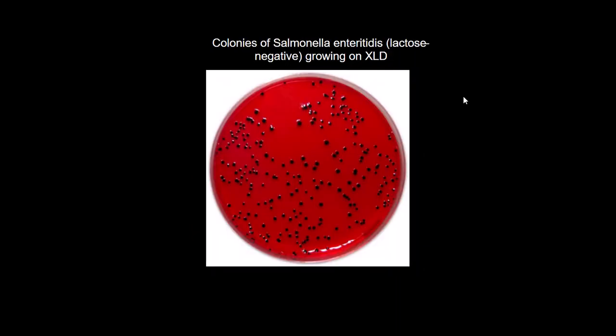So the rule of thumb here is to look for the lactose non-fermenting colonies in most of the media that we use for the isolation of the enteropathogens. Salmonella, Shigella, for example, all of them are non-fermenters. The others that are fermenters usually are not pathogens. Very important. This is the rule of thumb. But we have to look for the Escherichia coli, the pathogenic Escherichia coli that we have talked about. Very important to remember.